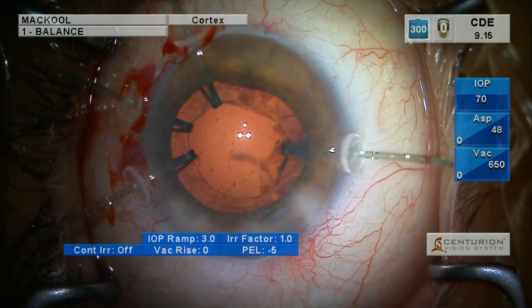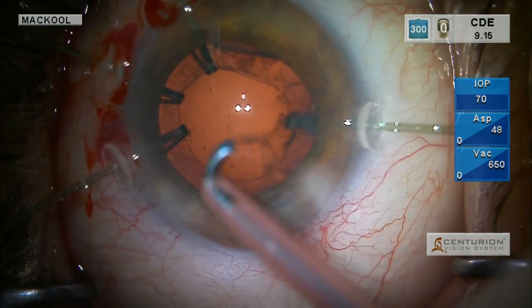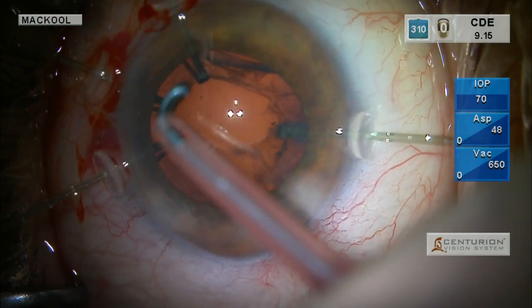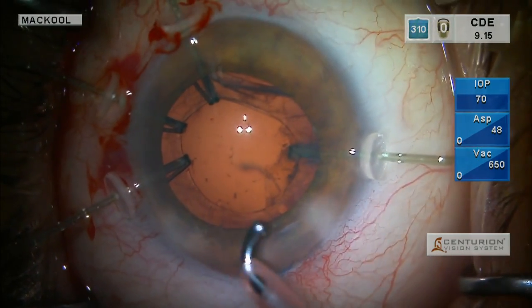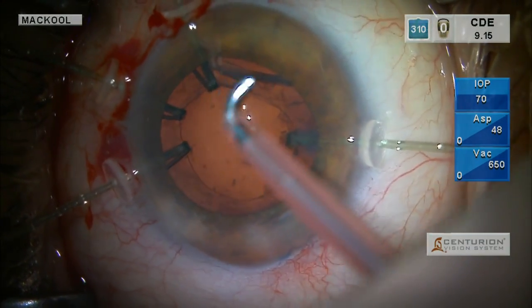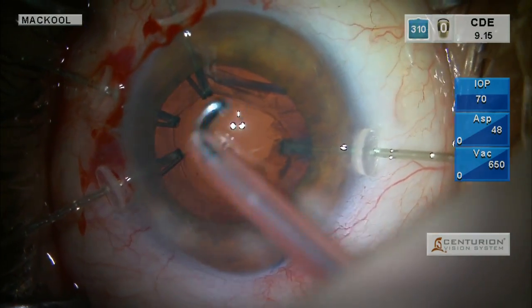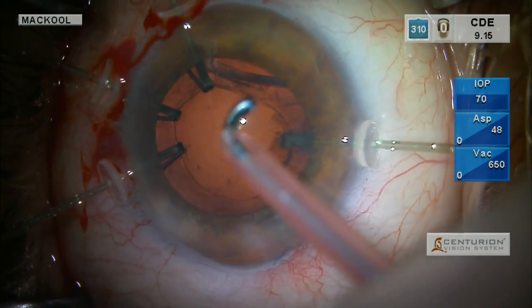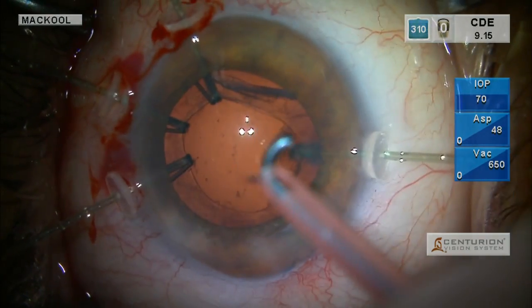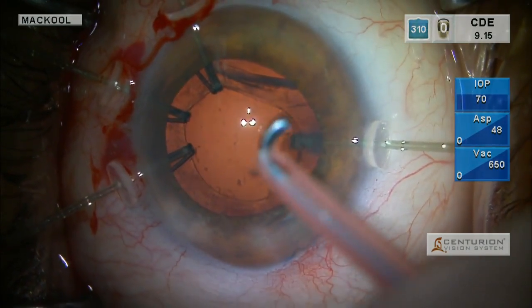Here's what I'm seeing in 3D that you can't tell from this view: the capsule here is more elevated than the posterior capsule here — there's an asymmetry. Over here, look at that: no zonule at all, none. So we're going to put some OVD in here and then put another retractor here. We may get vitreous that comes through this no-zonule region, and if so we'll do a vitrectomy and clear it up at some point during the procedure.